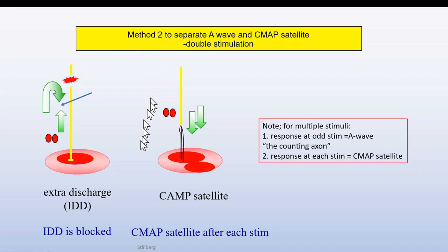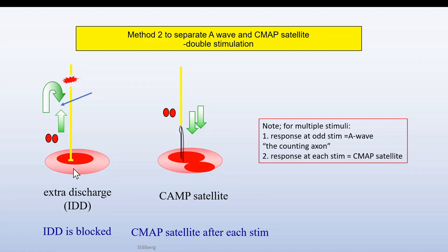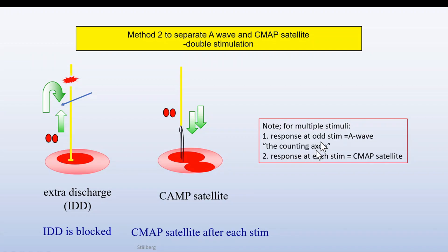Another method to separate A waves from CMAP satellites is by double stimulation. When we stimulate once, we get a late component. But if we stimulate two times with an interval of about three milliseconds, the second stimulation will block the response from the first, and we will not get any late component at all. If we give three stimuli, the coast is clear after the two first stimuli and now we can get the response. If we give four, then no response. If we give five, we get one response — the counting axon. For a CMAP satellite with double stimulation, we will get responses to both stimuli.